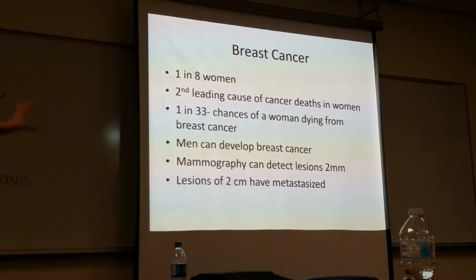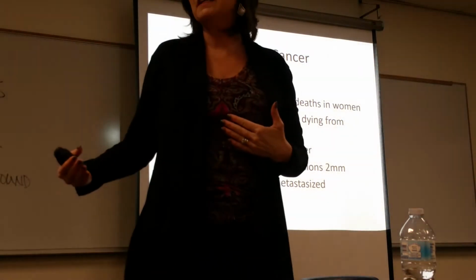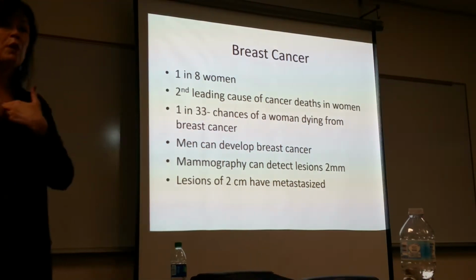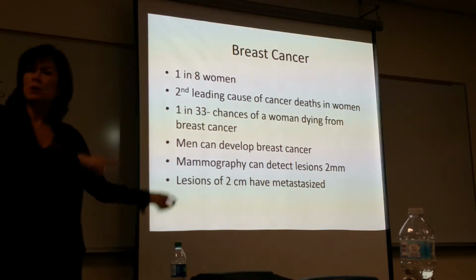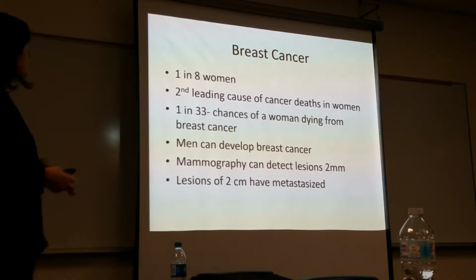As we go through this slide, I'm totally convinced we need licensing for mammography. You need to be properly trained, extensively trained, more than what I got. And I'll show you reasons why, but we're so much better at our imaging than we were before this licensing. And I'll go over that.